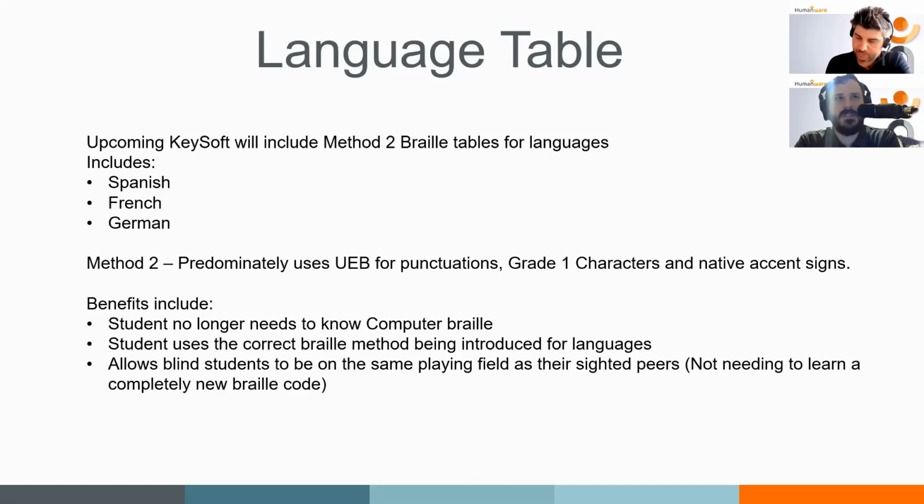Of course, these are BRF files, so the student worksheets are BRF files, so you don't need to run them through a Braille table because somebody's already created them to follow those tables. So you can just emboss the BRF, and it's going to be exactly what you want it to be because it's been created by a Brailleist or by somebody using a Braille translator, so you don't need to apply a table because they've already done it for you. But if you have a story about, I don't know, whatever story you're reading in class in 3rd or 4th grade or 2nd grade, whatever it may be, you can emboss that using these Braille tables through the Duxbury Braille translator.